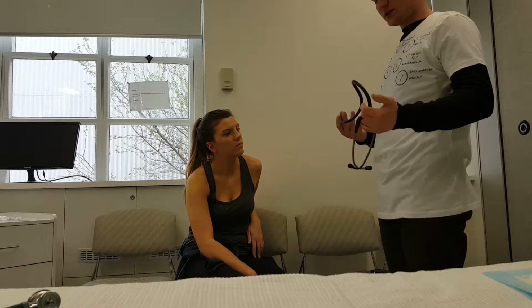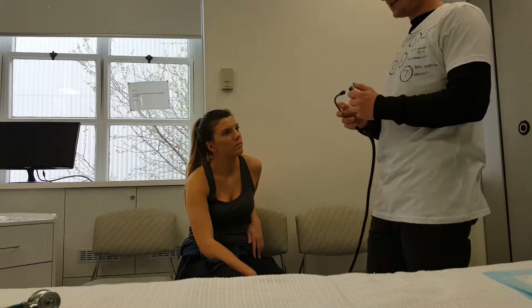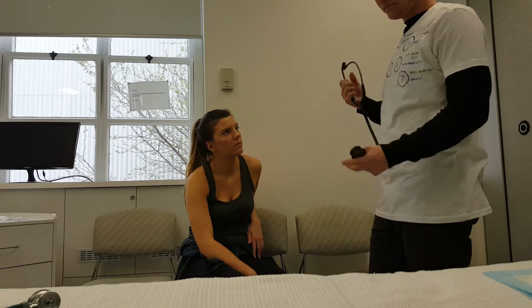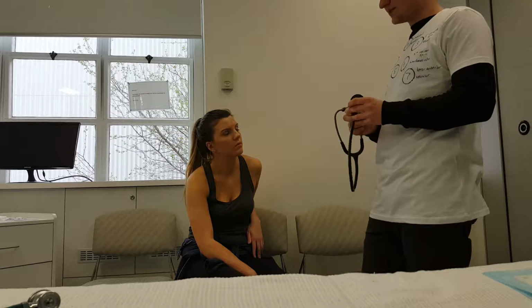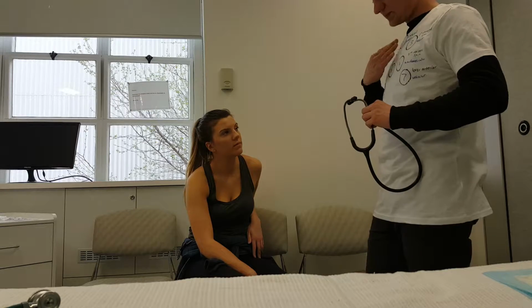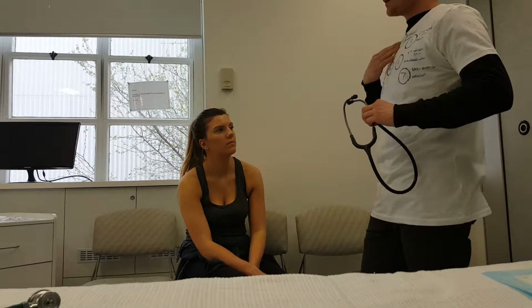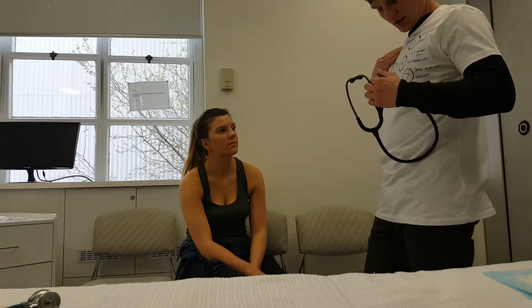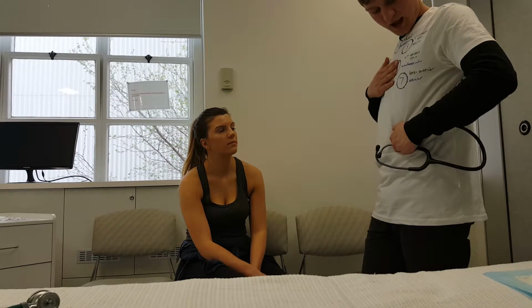Using a stethoscope is pretty simple. You'll have the stethoscope facing forwards in your ears. We'll be using the diaphragm for this with a decent amount of pressure onto the area that you'll be assessing. When you are using the stethoscope for chest sounds, you want to be comparing each side. So you start on one side, move to the next, and compare those two sounds, so you can make sure you've got equal sounds on both sides. And then moving down in the numbers indicated there.